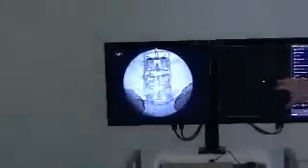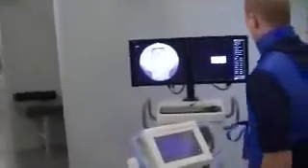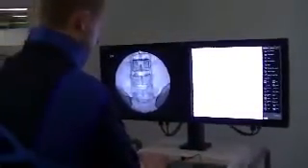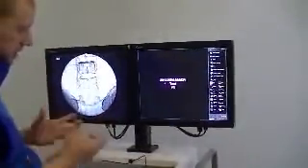Now if you save this, it will push it over to the second screen. We didn't register a patient yet, so let's show how to register a patient. You have your exposure tab, new patient, patient name. You can put in the patient ID, birth date, and all other information. Once you register the patient, you're ready to take your images and save them. You can save as many images as you want to whatever particular patient, and it's very easy to get images on and off this system.